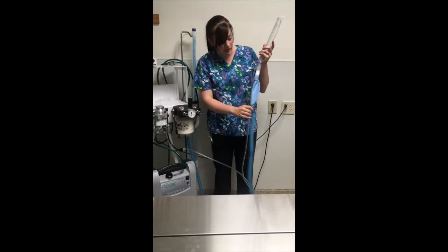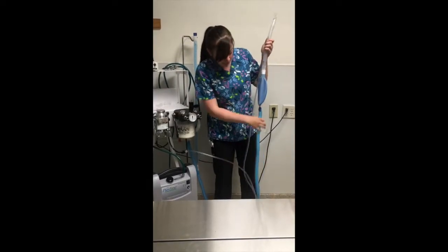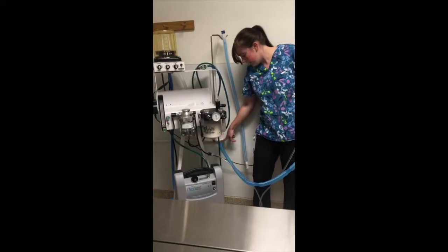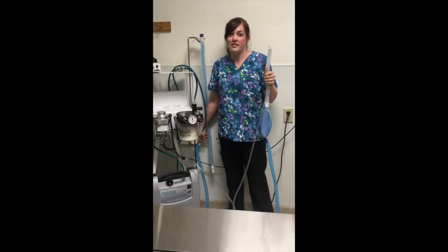You always want to leave it open if you're not intending to do that, so the patient can exhale. So once it's open, then the waste anesthetic gases come directly out to our scavenging system, which is then directed outside. That is our non-rebreathing system.